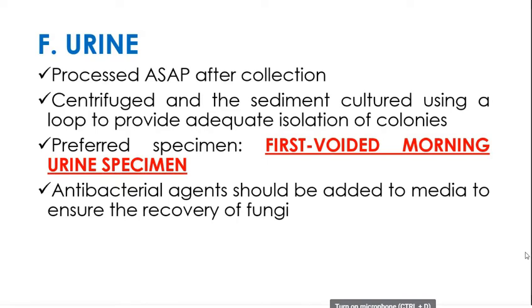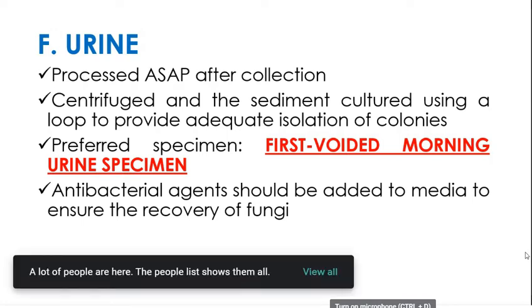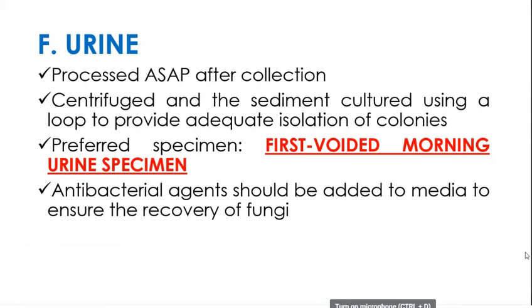Baka po makontaminate ng mga gram-negative bacilli. Paano napunta si gram-negative bacteria doon? Nabasa ko lang po kasi, oftenly contaminated with gram-negative bacteria. What is present in your urine? Where does your urine pass through? Kanina, sterile ang specimen coming from sterile sites, no need for antibacterial or antifungal agent. Urine, di ba ang dami niyang bacteria?